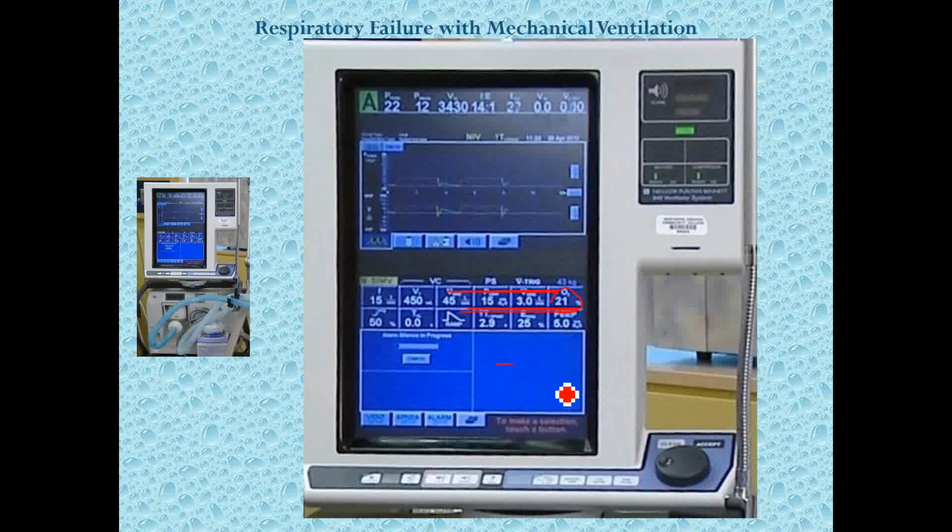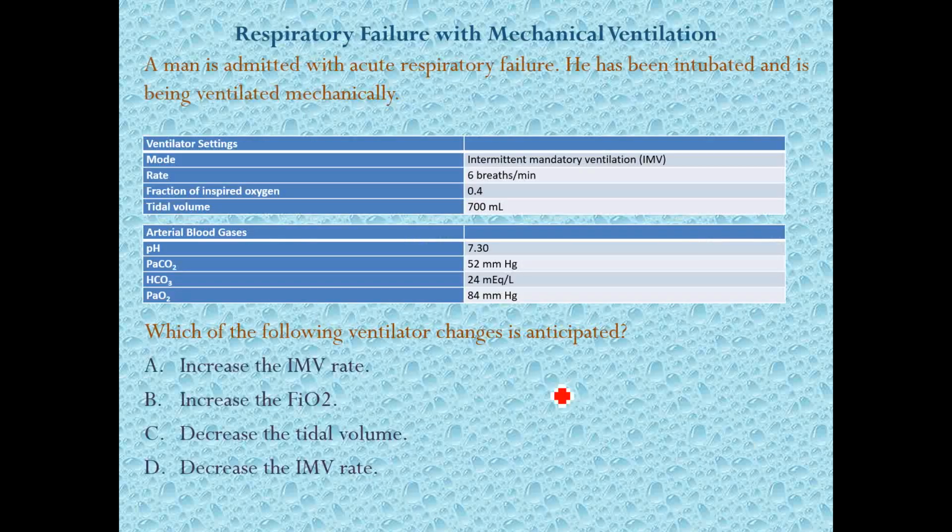But lots of extra O2, anything higher, especially I think Dr. Reed mentions 50%, then that has a detrimental effect. So it's always about risk versus benefit. If the patient is profoundly hypoxemic, well, the risk of an elevated supplemental O2 is worth it. But if they're not hypoxemic, then the risk is not worth it. So that's what you have to decide. You, or the physician, has to decide the risk versus the benefit. And so that's very important. All right, so let's keep moving on with our questions.